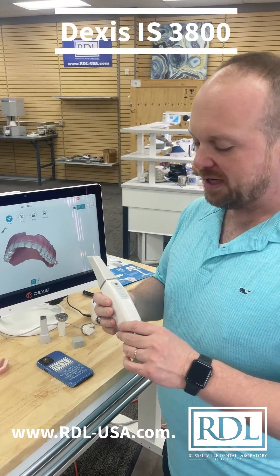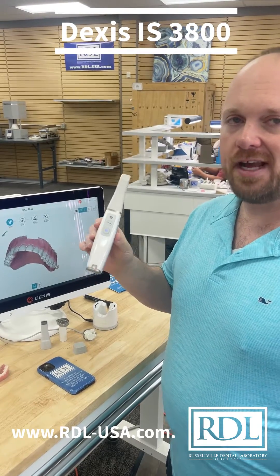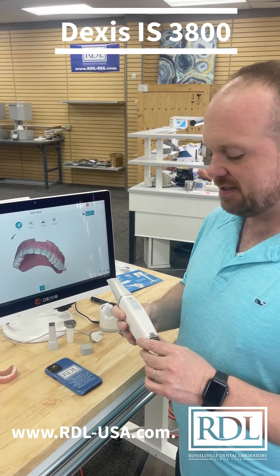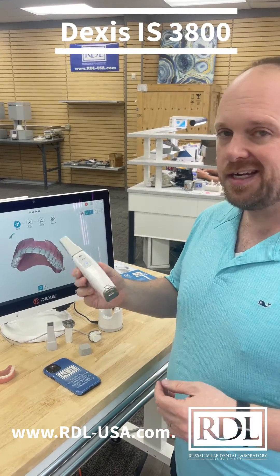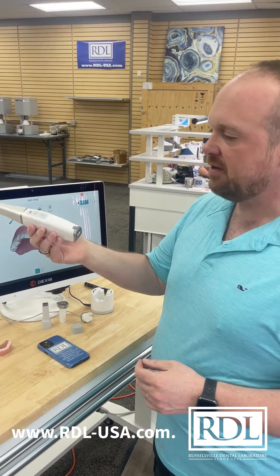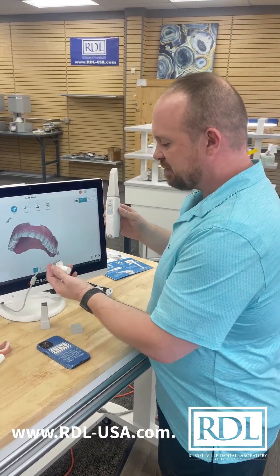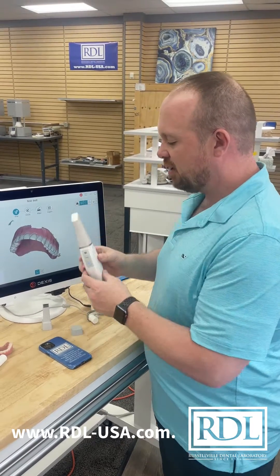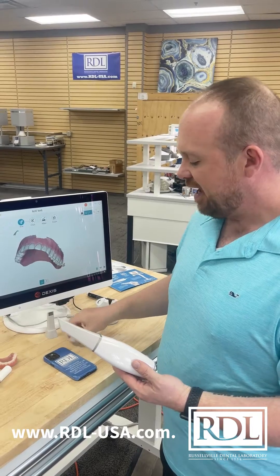Hey, I'm Lee Corsi with Russellville Dental Laboratory, and we're here with the DEXUS IS3800, available from DEXUS, part of the Invista brand of companies. If you haven't gotten your hands on this scanner, it's a really nice scanner available to use either wireless — it comes with an extra battery — or you can plug in directly and use it wired. It also has what they call a posterior tip, or tiny tip, that comes with it.